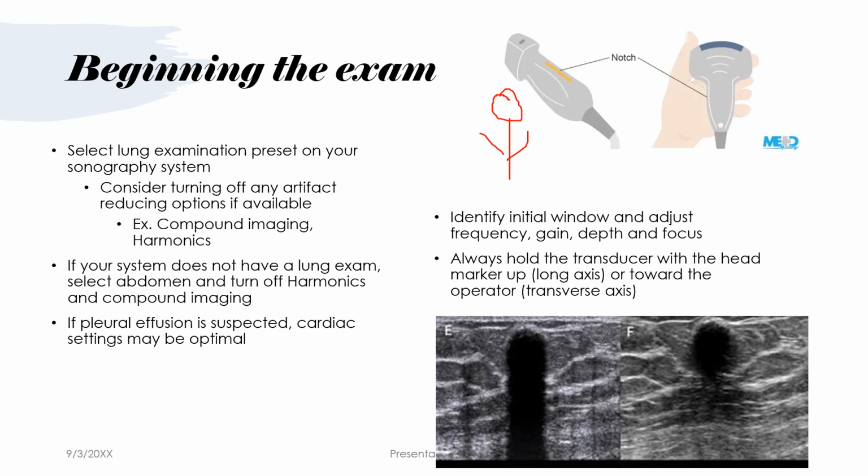There's some other things that are going to be really interesting and important considerations when you're scanning. One of the things that new technology with ultrasound has come out with is called compound imaging. Compound imaging, again, if you took the physics class, I'm sorry for the redundancy here, occurs when your transducer is obtaining images at angles. It obtains an image using scan lines moving one direction, the other direction, straight up and down, and who knows how many other directions, and it will compile all of those images and help prevent any loss of information.